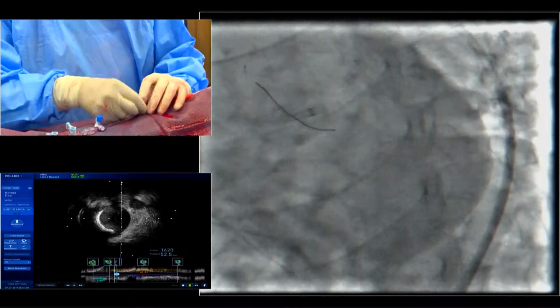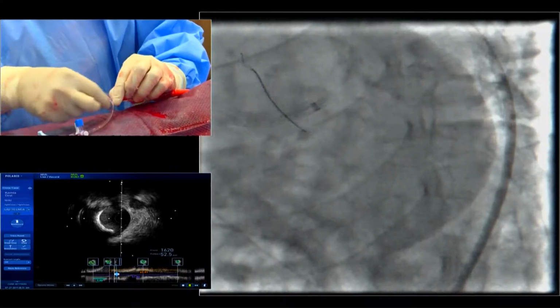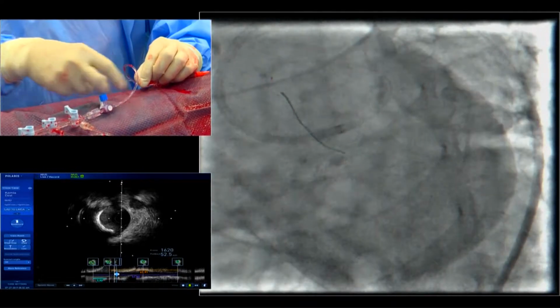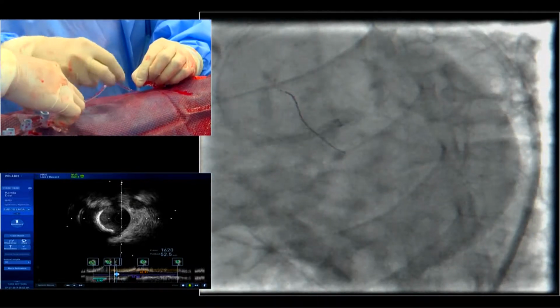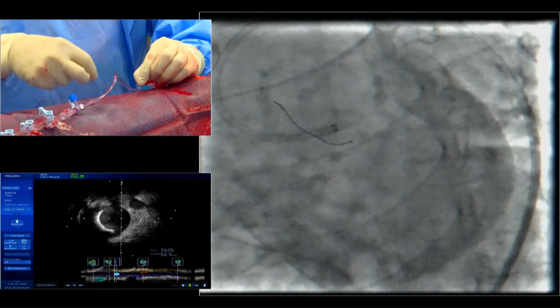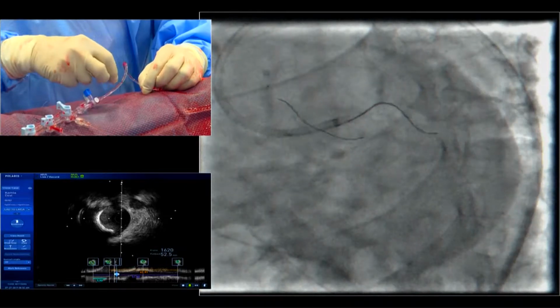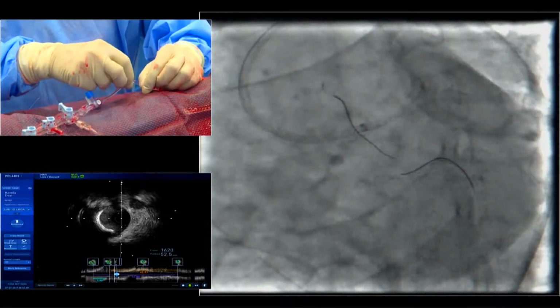Thank you very much. So you did a rota with 1.75, 160,000, never went to the mid part, and your major work is done. Now you've taken a wire in there. You have removed the rota wire also, right? And I'll just dilate it with the balloon. Okay. I'll take a balloon, maybe a scoring balloon, and just cut the things down.